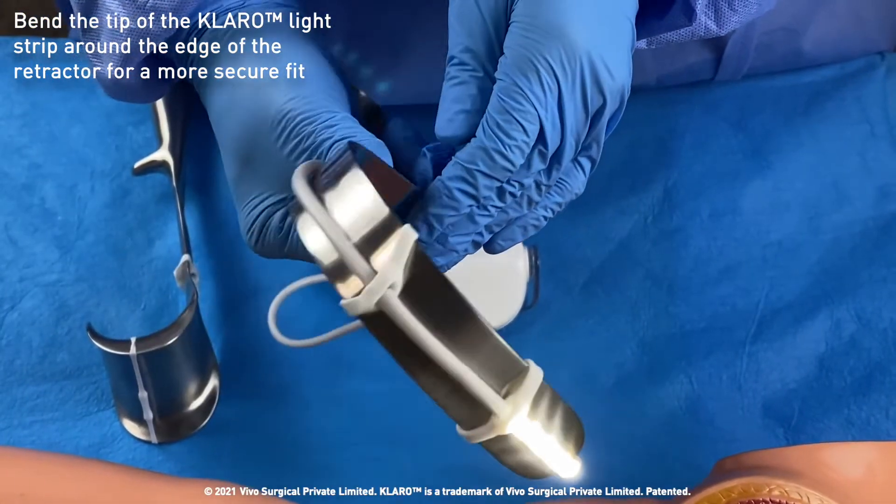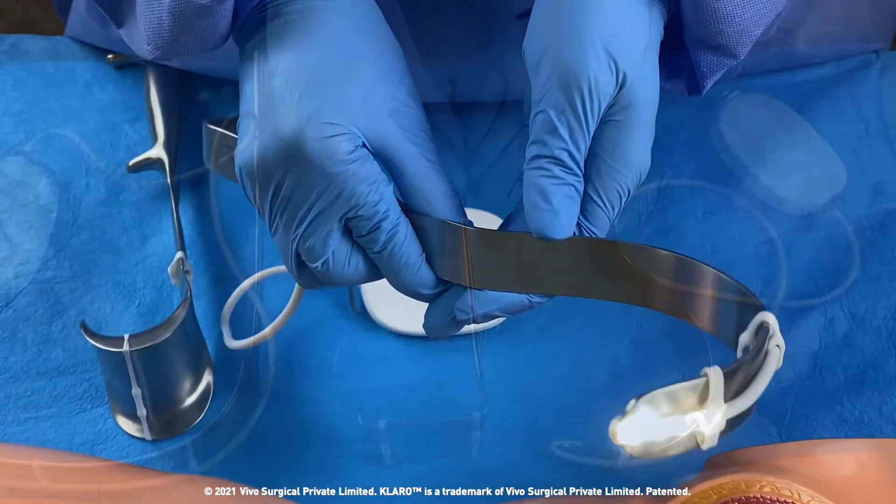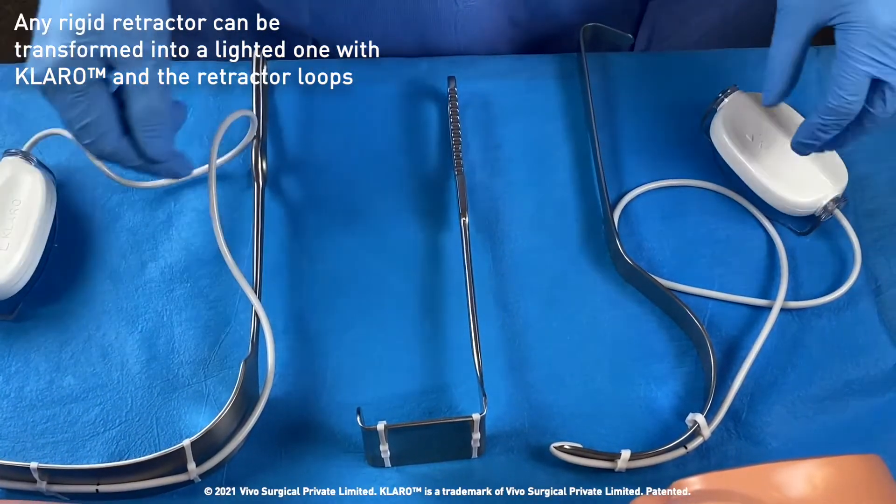There we go. With Claro, any rigid retractor can be transformed into a lighted one.